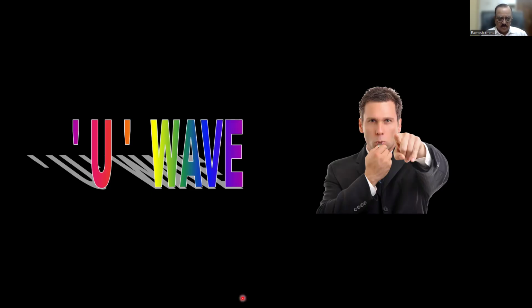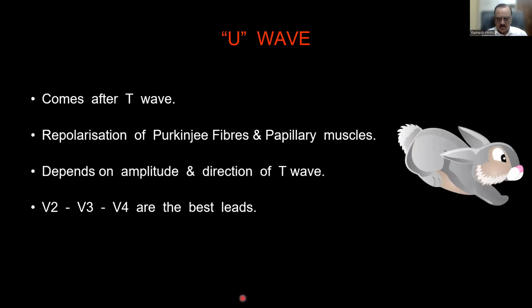I have not told you much about the U wave. What is the U wave? It is a small positive wave which comes after the T wave. We say PQRST. After that, there will be a small positive deflection for many people, not for all people. That wave is called the U wave. It represents the repolarization of Purkinje fibers and papillary muscles. This U wave is like the T wave. It depends upon the amplitude and direction of the T wave.